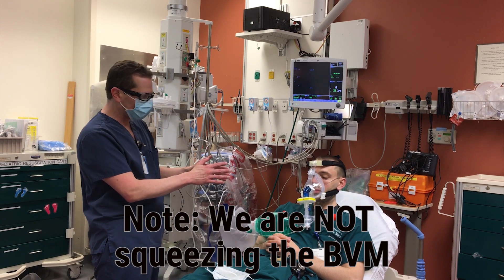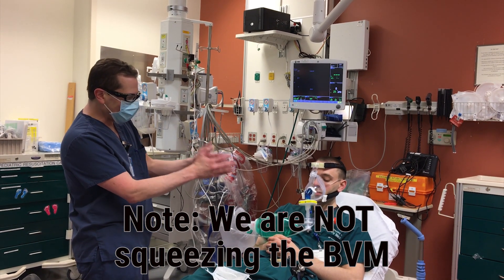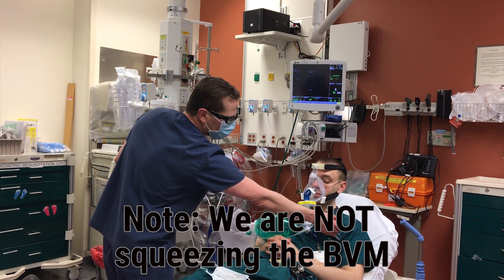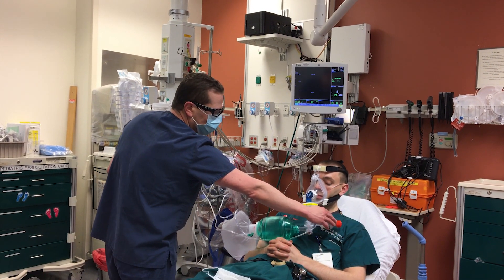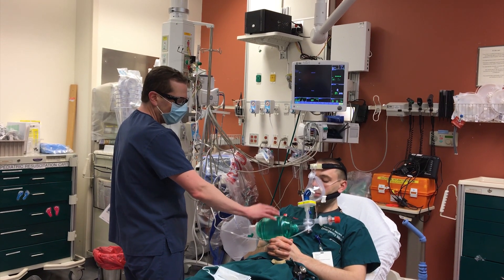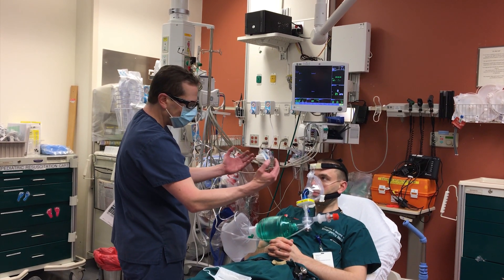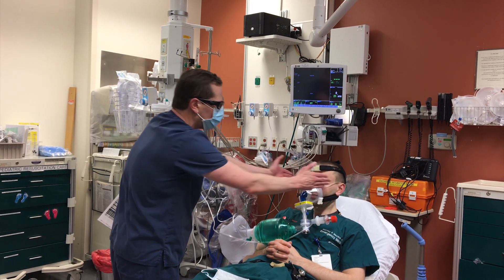I think it's the safest for providers. It's the best situation to provide CPAP and 100% — or close to — FiO2, because that's what these BVMs provide, so long as they have a PEEP valve on it. The PEEP valve is there both for PEEP, but also, even when it's at zero, it prevents any room air inhalation and therefore forces it to come from the reservoir and the bag to provide a high FiO2. It's protecting the staff. The only thing coming into the room is non-high-flow leak around the mask.